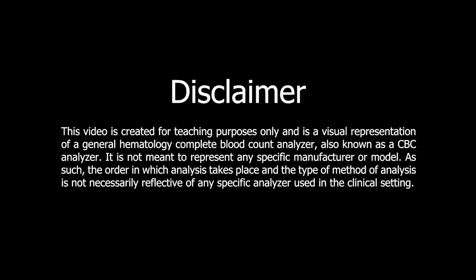This video is created for teaching purposes only and is a visual representation of a general hematology complete blood count analyzer, also known as a CBC analyzer. It is not meant to represent any specific manufacturer or model. As such, the order in which analysis takes place and the type of method of analysis is not necessarily reflective of any specific analyzer used in the clinical setting.